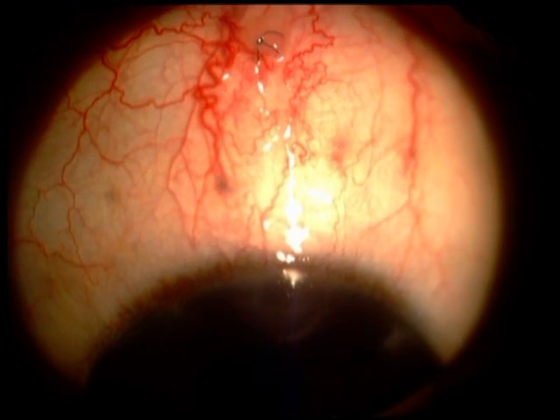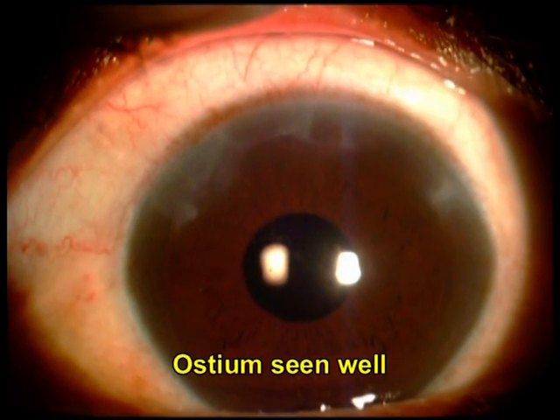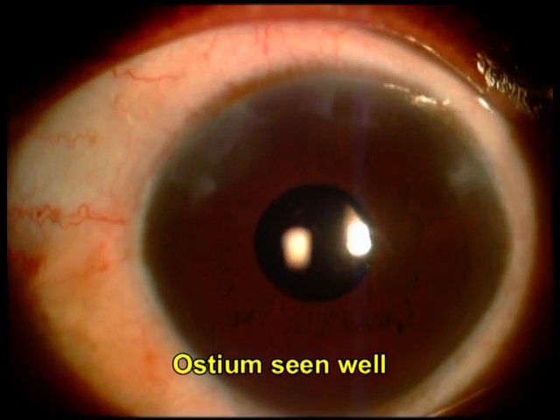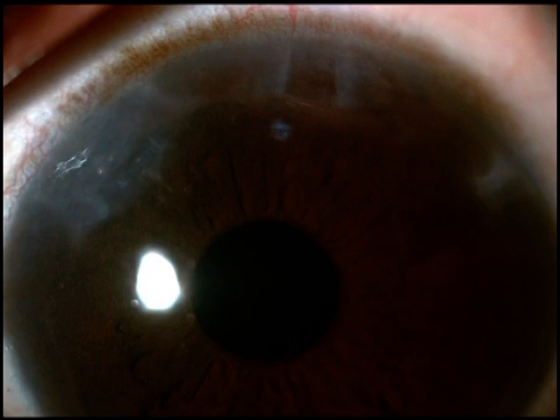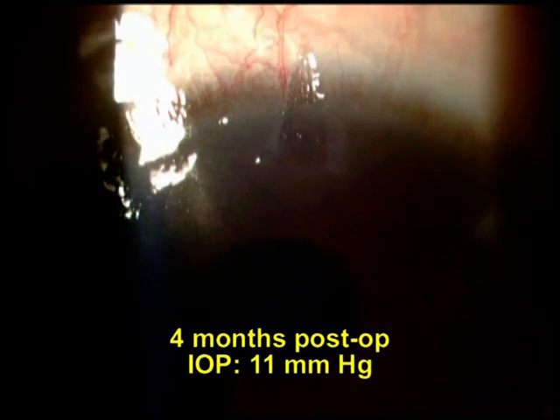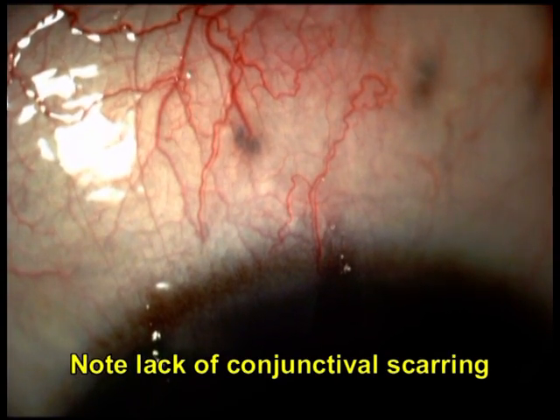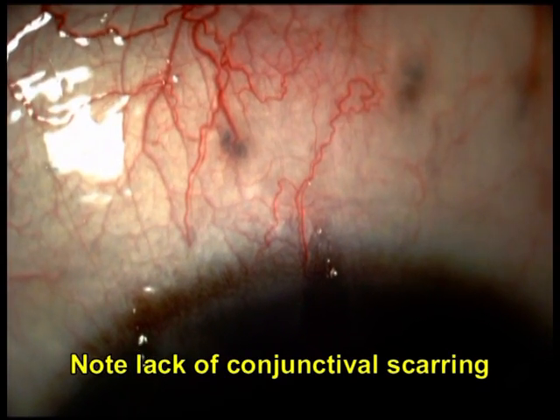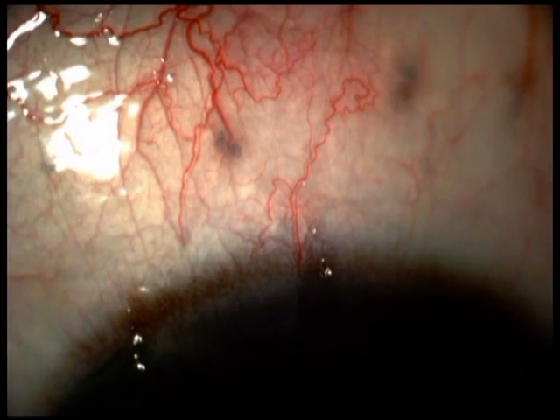SIGS alone may also be done in a technique very similar to what I showed here when combined with phacoemulsification. The technique is essentially similar — the conjunctiva is pushed forward and the single-step entry is made into the anterior chamber, followed by punching out of the internal corneal lip of the tunnel, which compromises the tunnel. This is followed by checking for adequacy of leak and finally conjunctival closure. Care should be taken that the punch does not extend way beyond the limbus into the scleral side, which might cause excessively large amounts of leak and post-operative shallow AC.